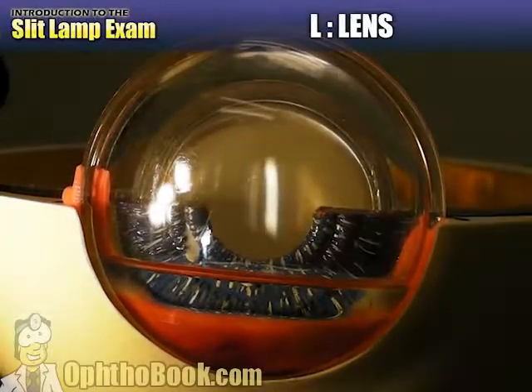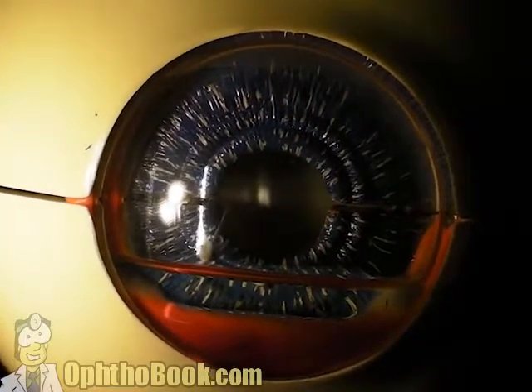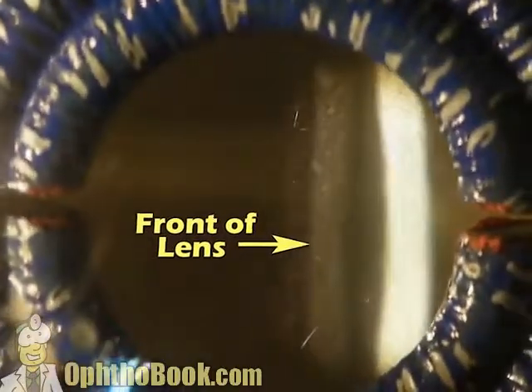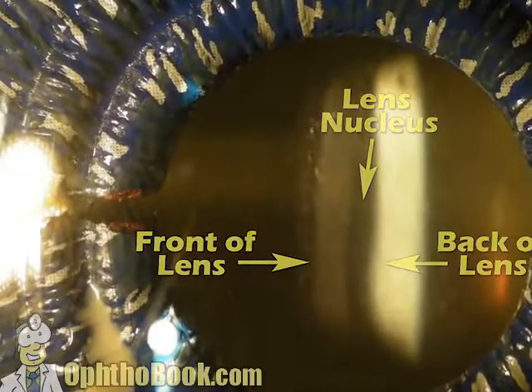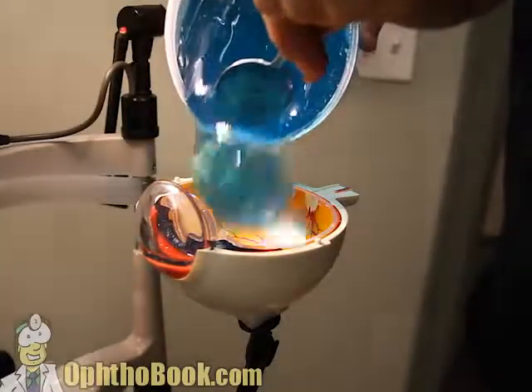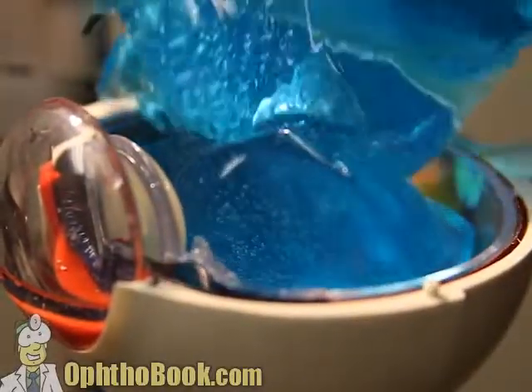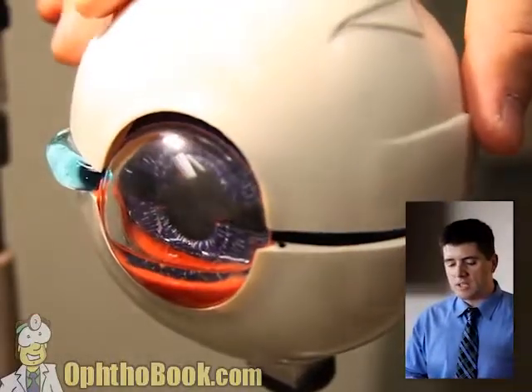Behind the iris is the lens. Because it sits behind there, you can only see it by looking through the pupil. The lens is another clear structure just like the cornea, so we can use our cross-sectional beam to look at it in the exact same way. You can actually see the front of the lens, the back of the lens, and the part in between — the lens nucleus — which is where people mostly develop their cataract. Behind the lens is the vitreous cavity, which mostly looks dark because it's optically empty, filled with a clear fluid very much like Jell-O. Unless there are red blood cells or retinal detachment, it looks like a dark space.